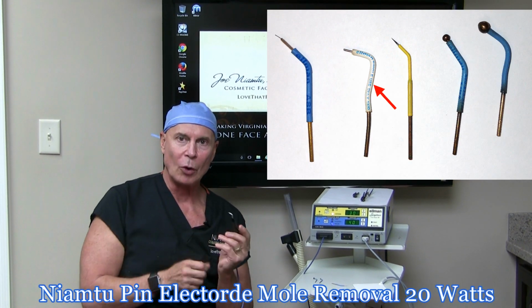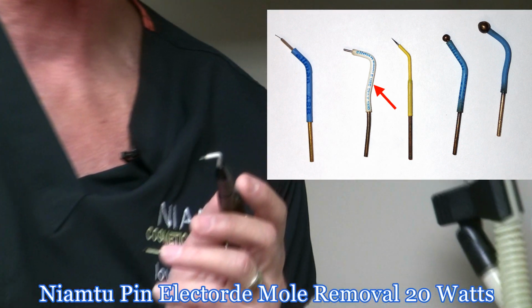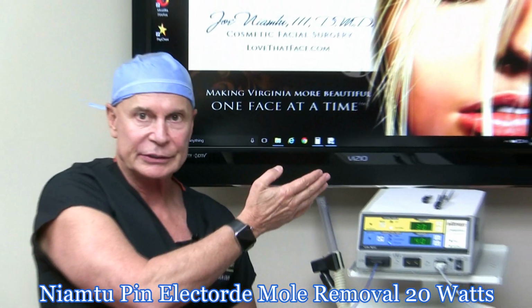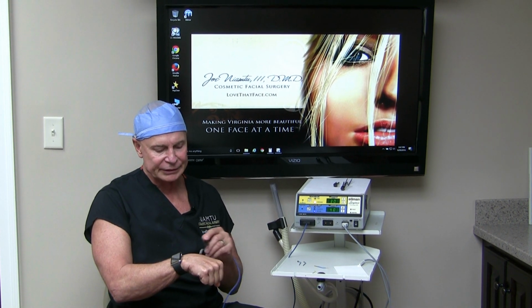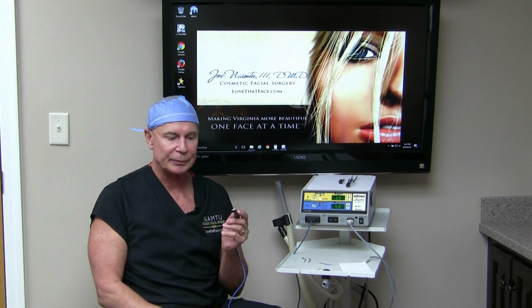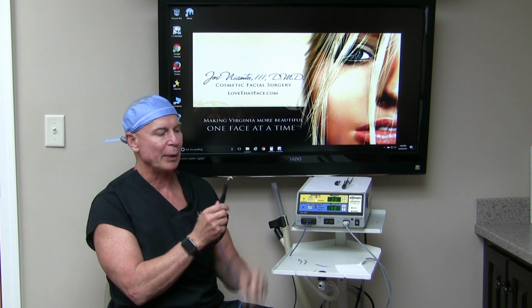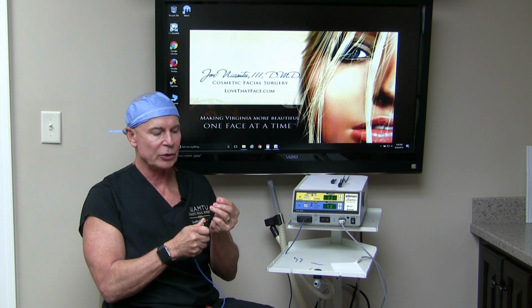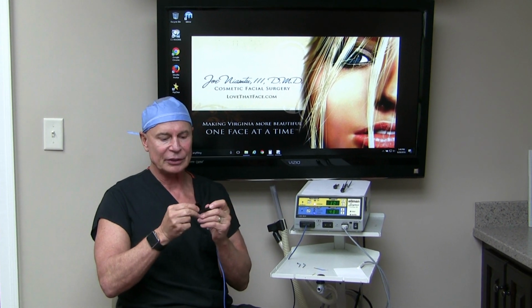And this is what I use for mole removal and lesion removal. It has a little thicker pin, like the size of a small pencil lead. And again, I'll show you these on the screen here. So this is just to melt down lesions, and it has a flat tip and it's rigid. Now, most of these electrodes can be bent, and that's great because you can shape them any way you want to, as the song says. So you don't have to bend over, you can just change the electrode.